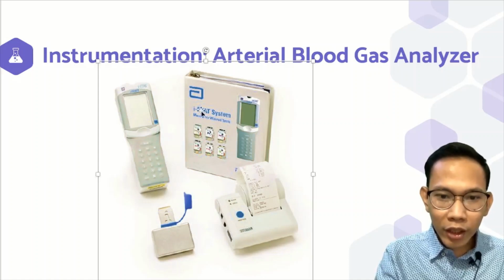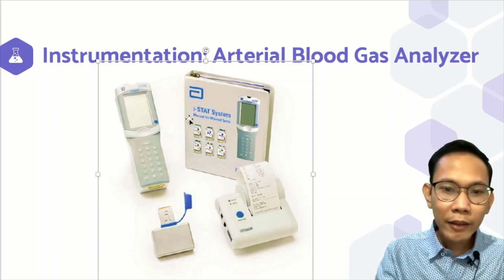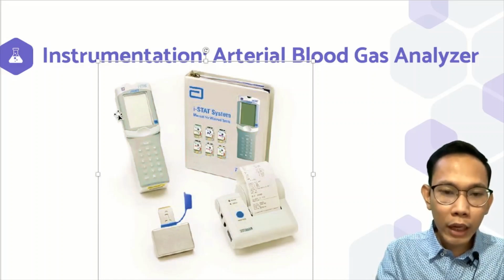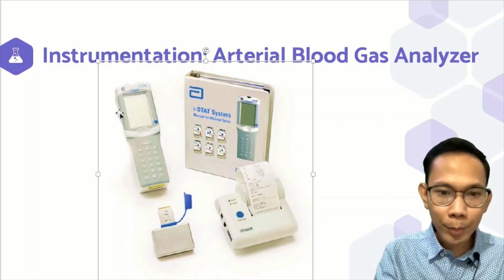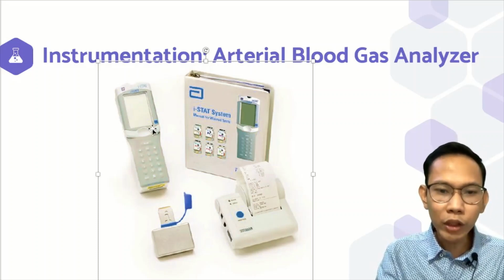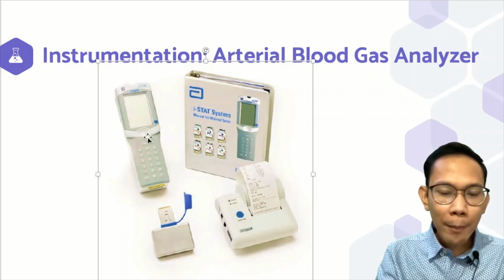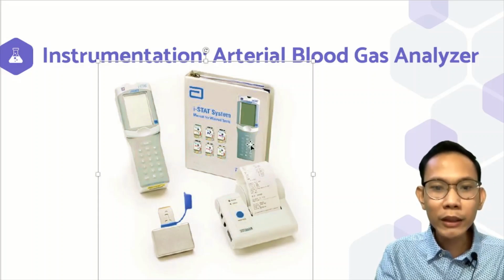Tapos, yung cartridge na yan, lalagyan mo lang ng parang few drops galing sa syringe. Tapos ipapasok mo dito, and then it will now give you the result of your ABG. Lahat yung pH, PCO2, PO2. Ganyan lang. As very simple as that in less than a minute. And then pag may result na diyan, may pipindutin lang kami dito, tapos lalabas na yung print, magpa-print na siya ng paper. Ito na yung result namin.